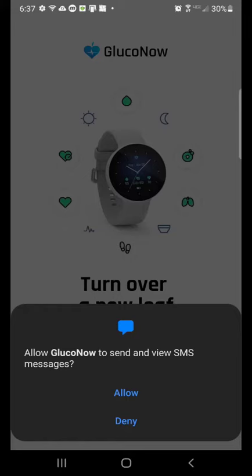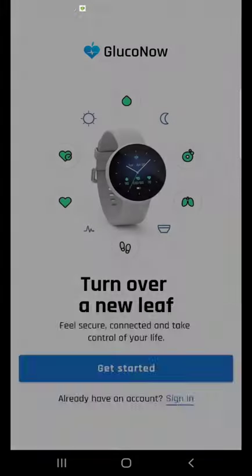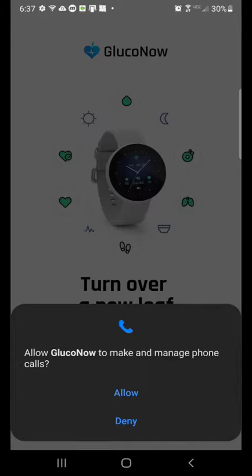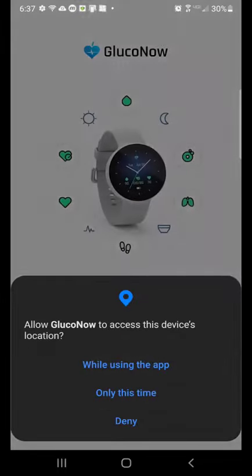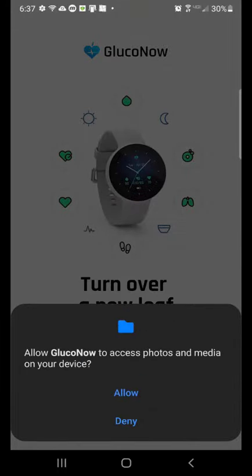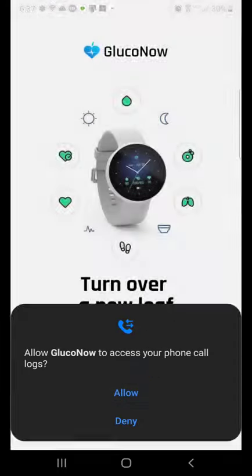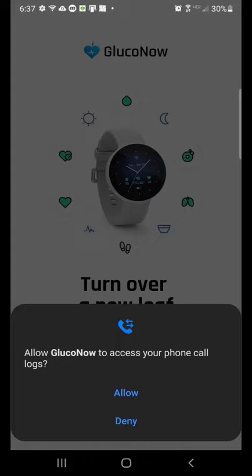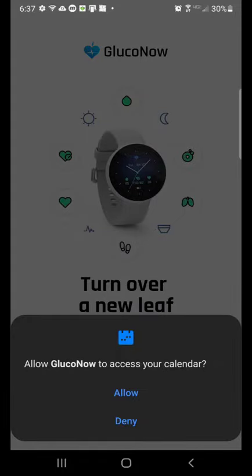After installing it on your mobile phone, when you start GlucoNow, it will show a series of screens for you to approve access to various device functionality. You need to allow all these accesses for the optimal functioning of the app.